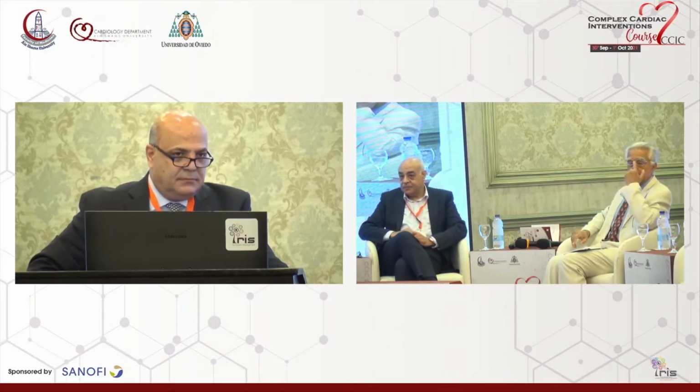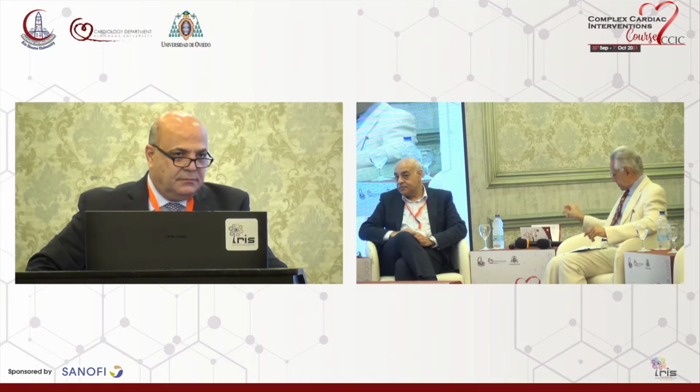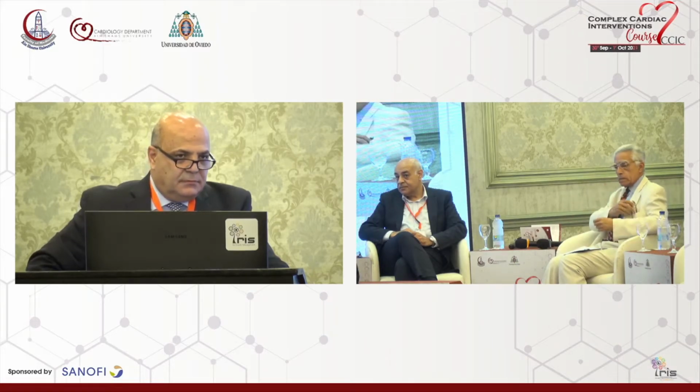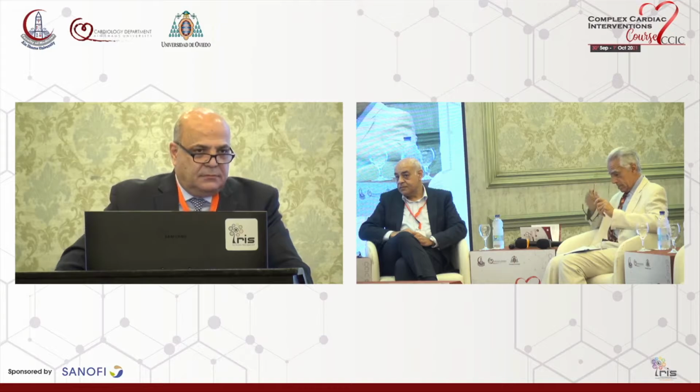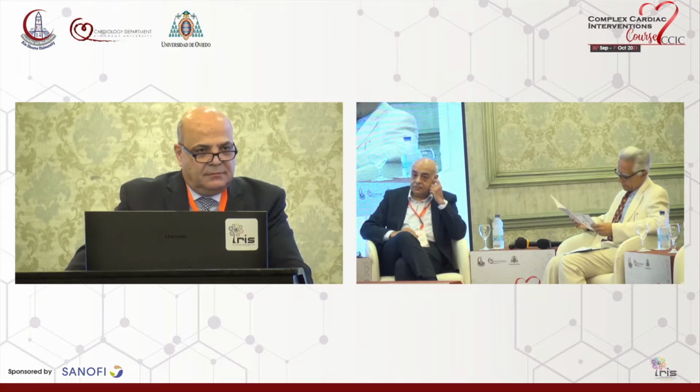Thanks, Dr. Nabil, for your excellent, challenging case. But if you are applying the IFR in this case, according to the RIPCORD trial, which was released recently at ESC 2021, which showed that there is no need for routine FFR, no increase in the cost, and no increase in cardiac events, and it has no value in cases of multiple stenting, how can we apply this trial in this case?